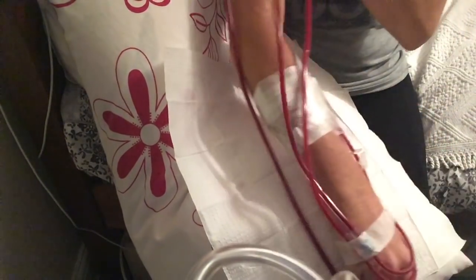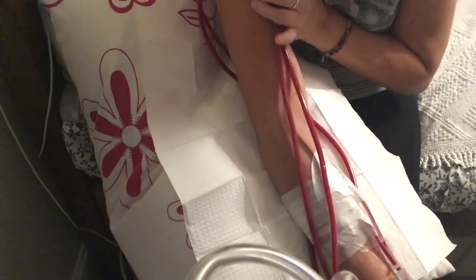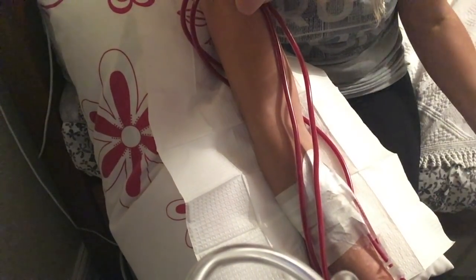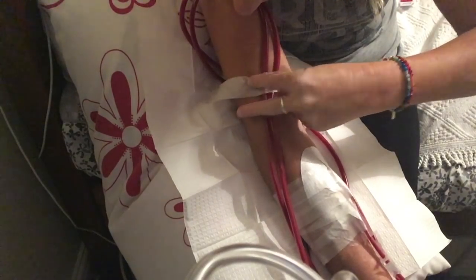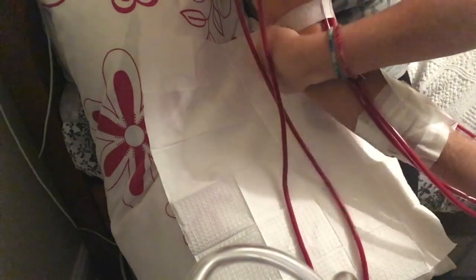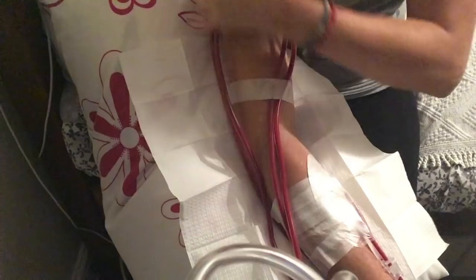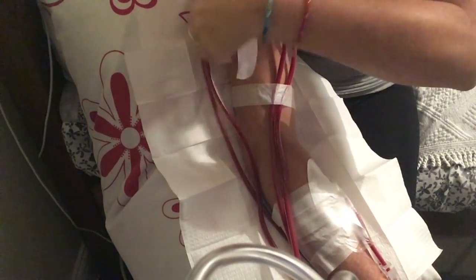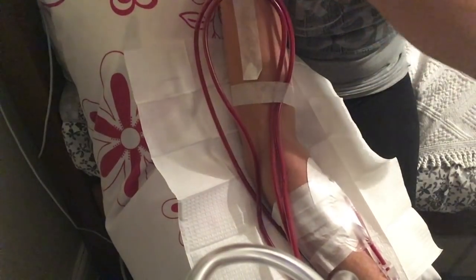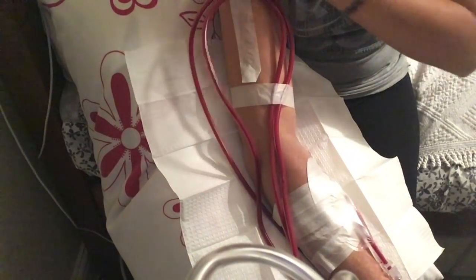This is why we have extra-long lines for nocturnal. I put another piece of tape up here — I have to hold it with my chin, but the tape's already prepared so I can just stick a piece across. Then the final piece at the top, just to tape the lines there. This is where they loop round, and where they then go to the machine itself.